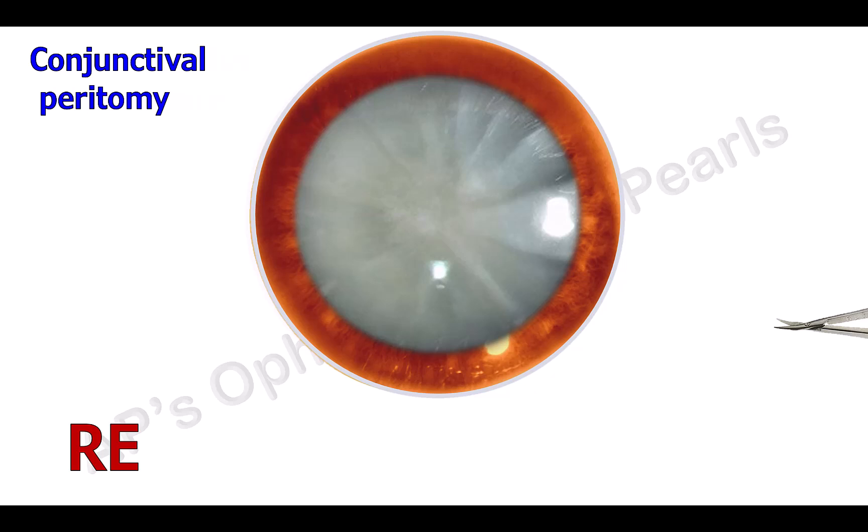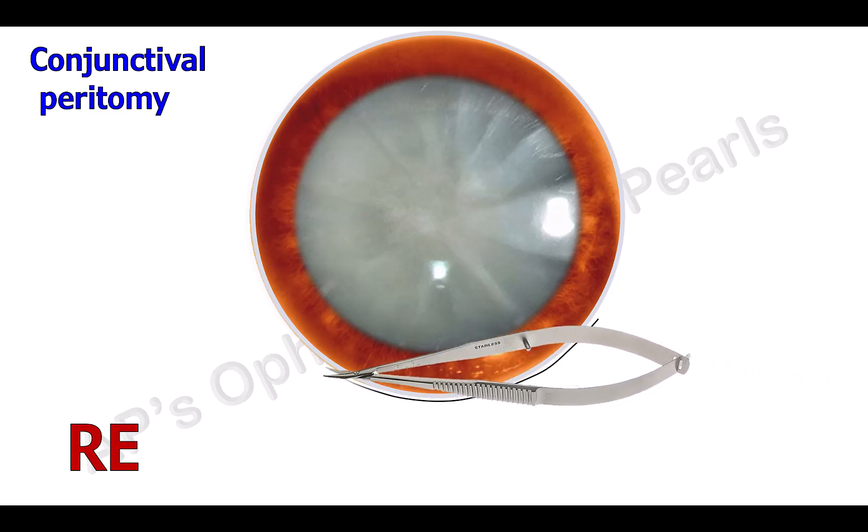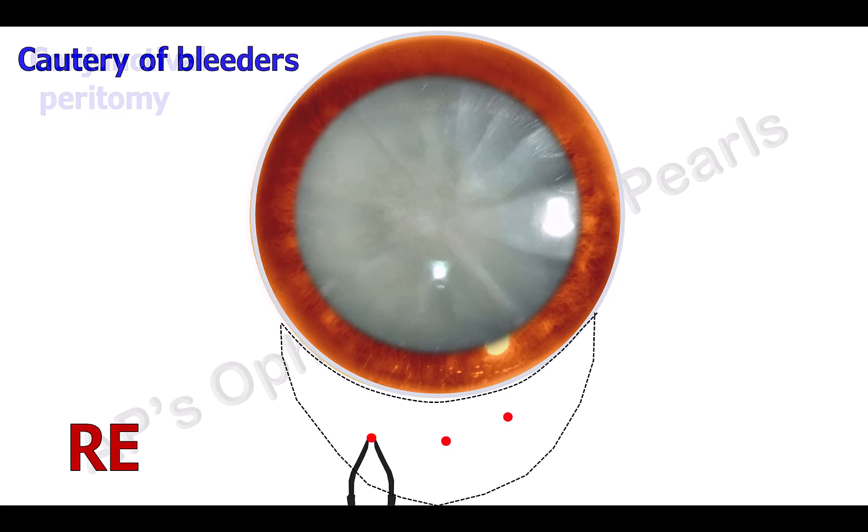Next is the opening of the conjunctiva, or conjunctival peritomy. Using a conjunctival scissors, a fornix-based flap is made — that is, a flap with an incision at the limbus which is reflected towards the fornix. Bleeders are cauterized with a bipolar cautery.